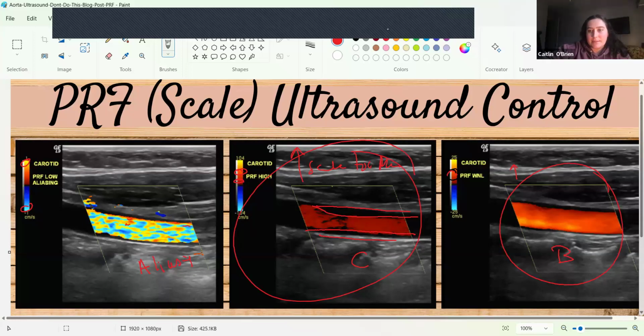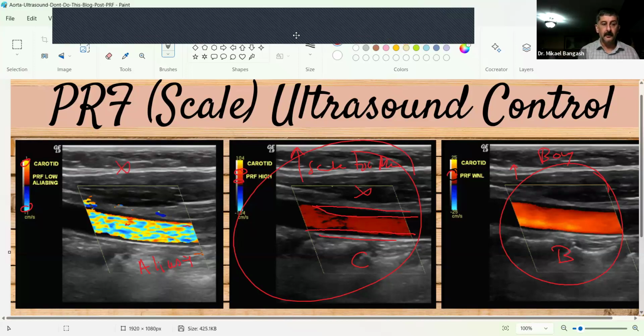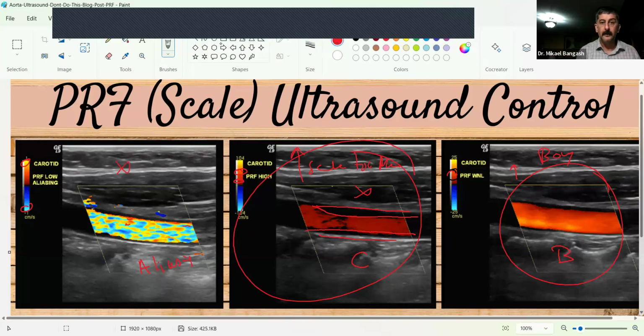Yes. Okay. So what would be an optimal image here? B, as in boy. This here is not optimal. This here is not optimal. Now, a little cheat, although don't rely on those because they may cover those up on your tests and things like that.